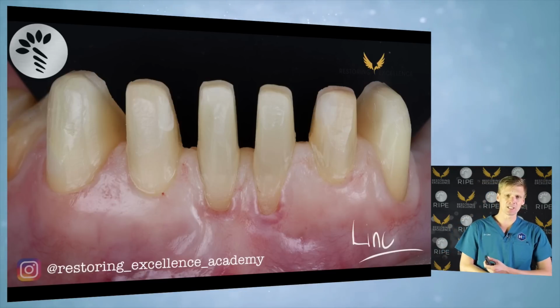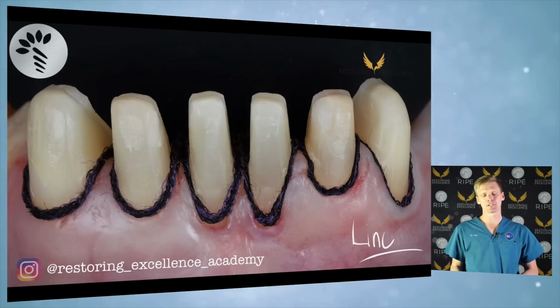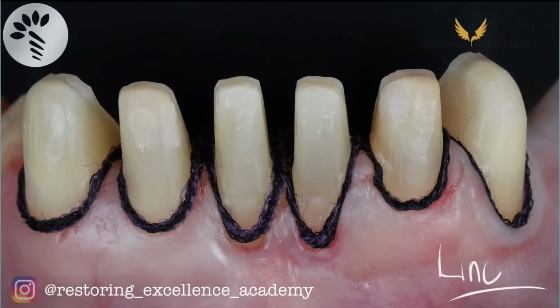Now in this case it's veneers, the tissue is super healthy. Is it at risk of recession? Absolutely. Am I going to pack 2 cords when there's risk of recession? Definitely not. Definitely no fat cord. Definitely not using a thick cord in this case, because if I use a thick cord with delicate tissue like this, I'll definitely cause recession.